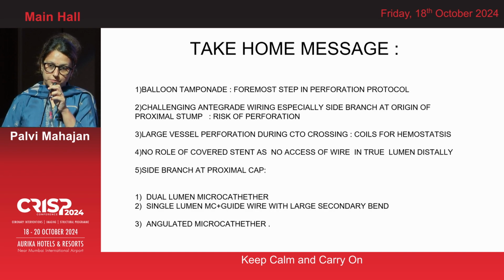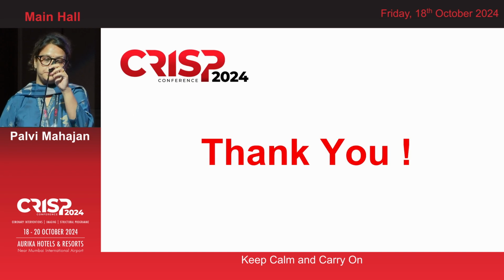Whenever there is a side branch at the proximal cap, take the help of a dual lumen microcatheter, or a single lumen microcatheter with a guide wire with a large secondary bend could also be taken, or an angulated microcatheter can also be of help. Thank you.